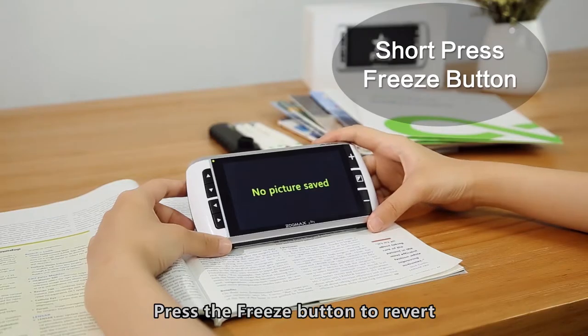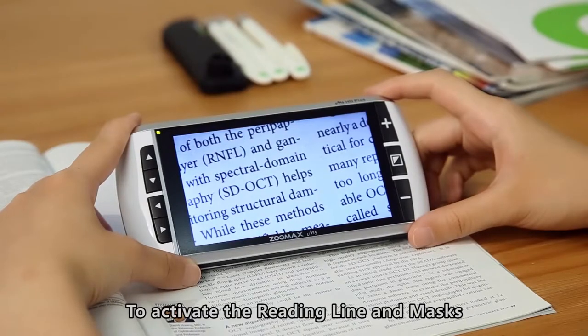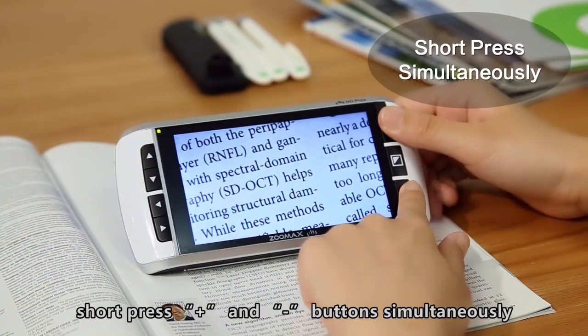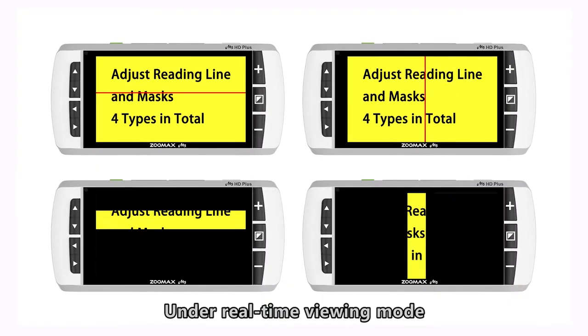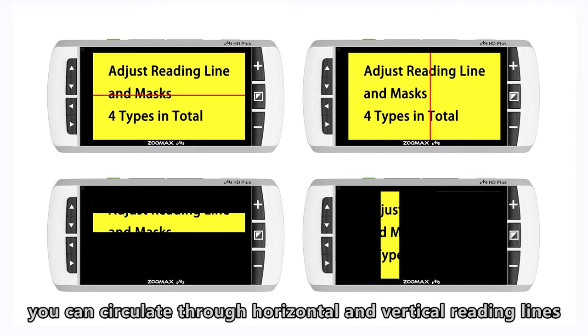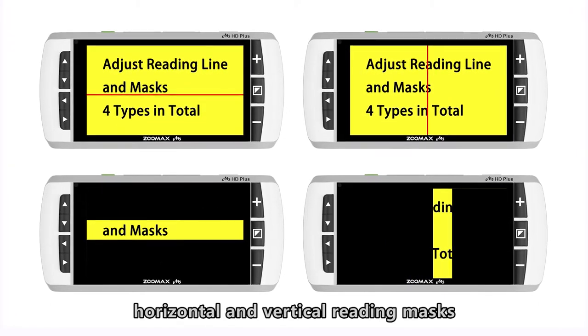Press the Freeze button to revert to real-time viewing mode after the photo operation. To activate the Reading Line and Masks, short-press the Zoom In and Zoom Out buttons simultaneously. Under the real-time viewing mode, you can circulate through horizontal and vertical reading lines and horizontal and vertical reading masks.